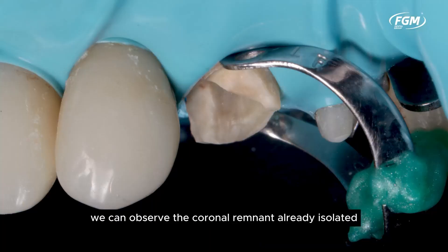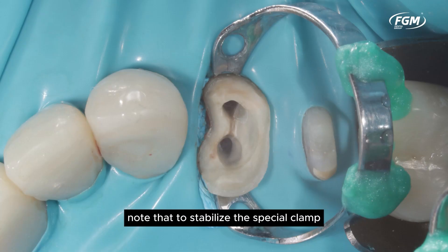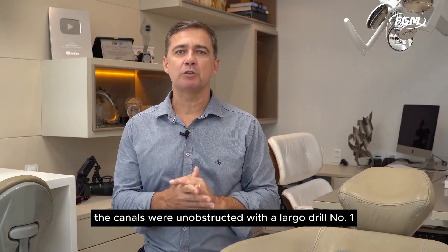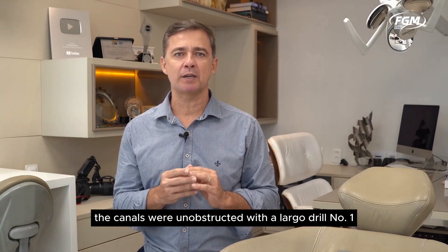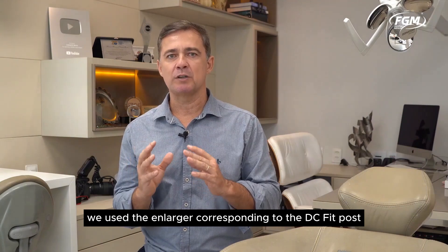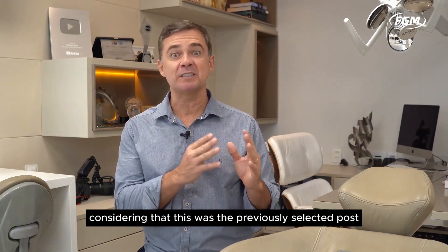In this image, we can observe the coronal remnant already isolated after the removal of the restorative material and access to the root canals in Unit 24. Note that to stabilize the special clamp, we used a resin-type top dam. The canals were unobstructed with a Largo Drill No. 1, and in the initial third of the canals, we used the enlarger corresponding to the DC fit post, considering that this was the previously selected post.